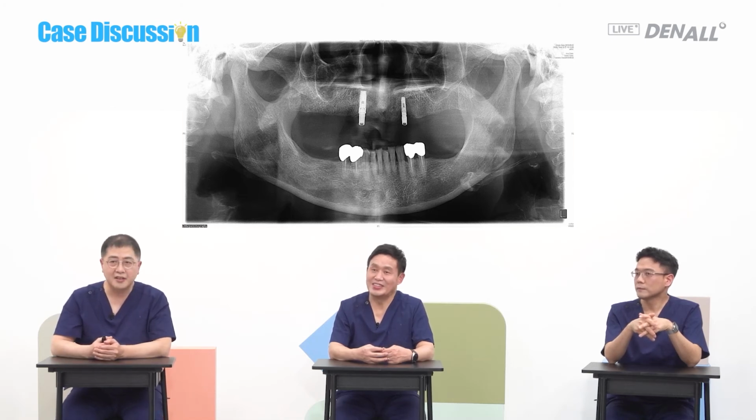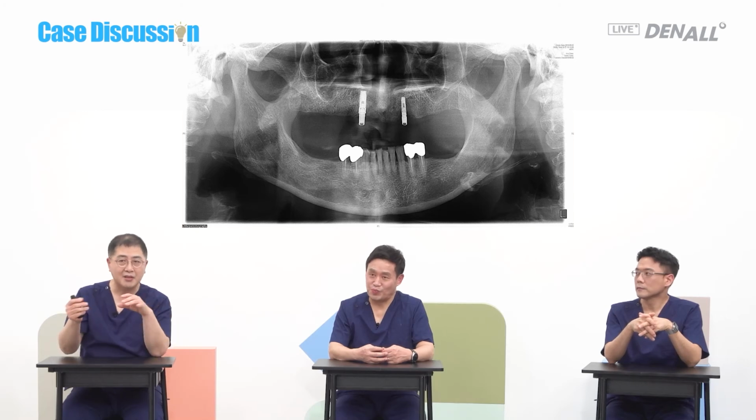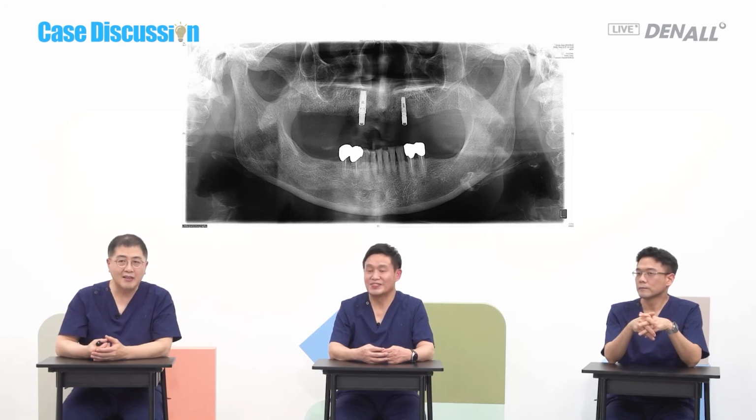And at number 3, the clasp should be there, so it is not good there. May I ask a question? Implant supported overdenture. No, this is RPD. Tissue support. So you have been successfully doing this, and I believe this is backed up by evidence. Do you have any know-how for impression taking?